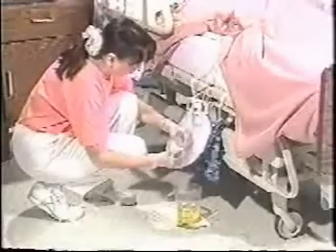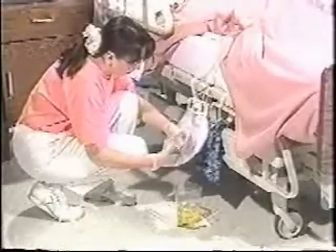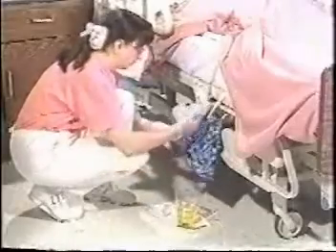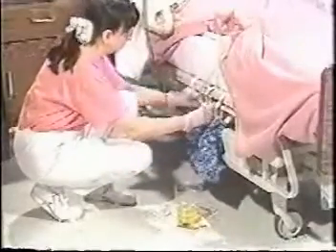Close the spout and wipe with an antiseptic wipe. Replace the spout in the holder on the bag. Replace the drainage bag back into the bag cover. Pick up the graduate and paper towel and dispose of the paper towel.